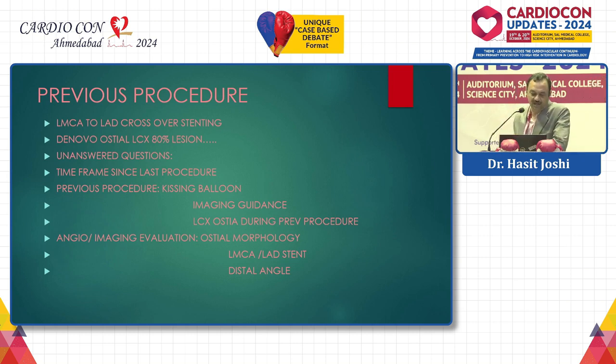So now there are many unanswered questions. One thing is time frame from the last procedure. When did this de novo lesion occur? Whether the process had started immediately after the procedure or not. Whether it is a new lesion developing right now. Whether there is any in-stent restenosis in the LMCA to LAD stent.